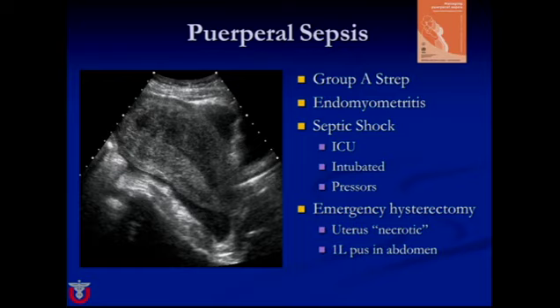A CT scan was performed, and she continued to deteriorate, so she eventually was transferred to our ICU where she was intubated, required intense fluid resuscitation and pressure support. The MFM people that I work with asked us to do an ultrasound that morning in ICU prior to them going to the operating room because they clinically had diagnosed that she had postpartum sepsis. They just wanted to have an idea of how large the uterus was.